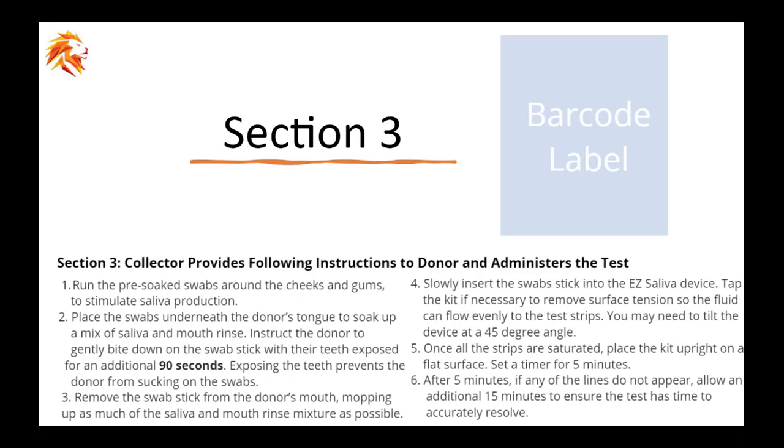Section 3 has no fields that need to be filled out. However, the collector will read the instructions provided to the donor. This will help the donor feel more comfortable and informed during the administration of the test. Please note, based on the version of test and type of collection you are using, the instructions may be slightly different and were included in your welcome email.